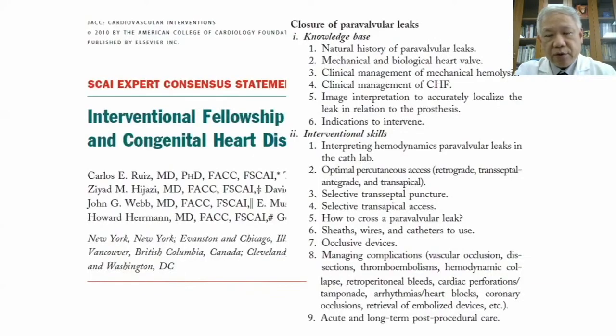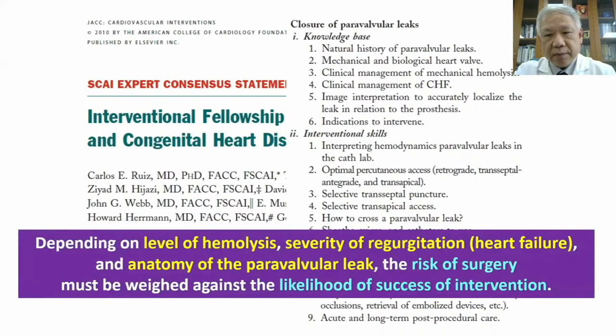The clinical indications of leak closure are hemolysis and/or PVL-related heart failure. We can evaluate the risk of surgery and the likelihood of success of intervention before intervention.